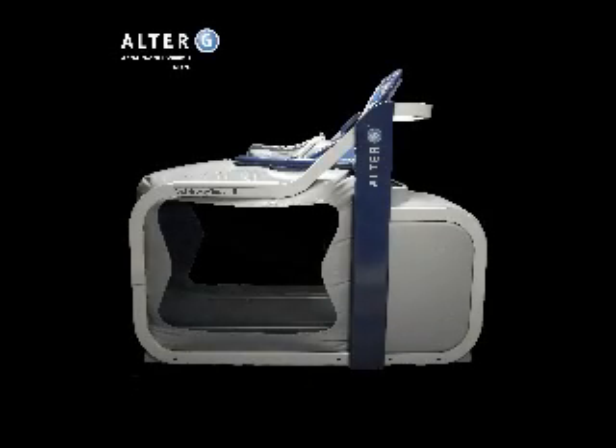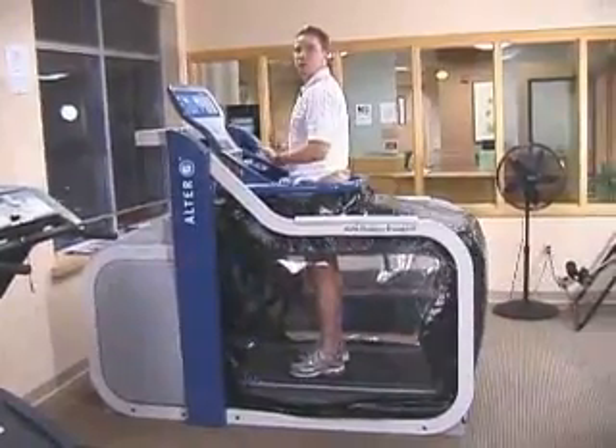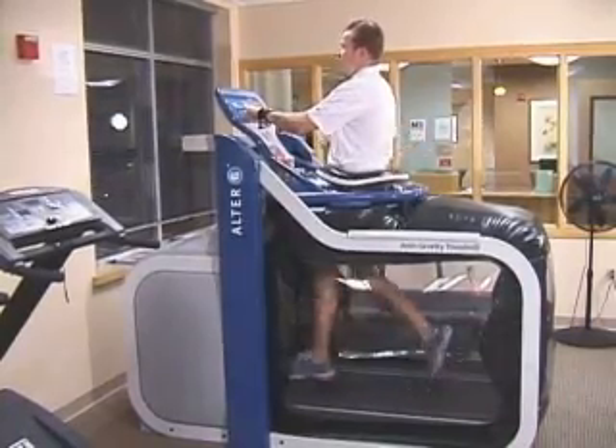Each year, physical therapists help millions of people rehabilitating from orthopedic and neurological disabilities. The Alter-G anti-gravity treadmill represents a dramatic improvement in therapy options.